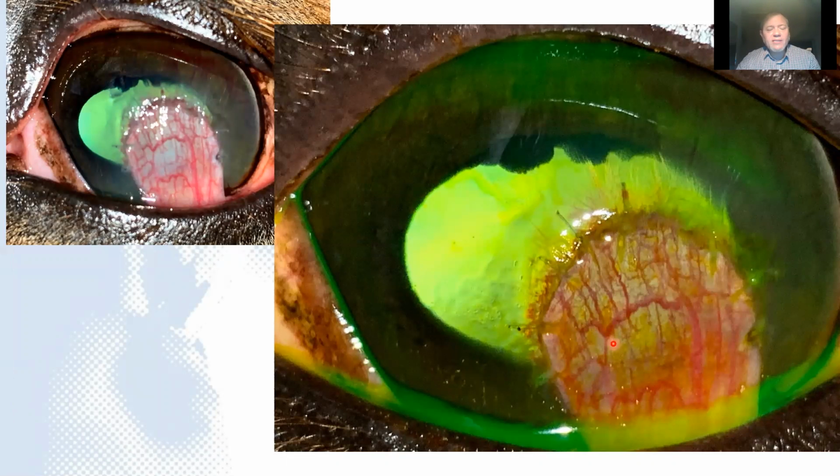Another similar case, another fungal keratitis with a conjunctival graft, and again we can see by just changing our angle of light that we can actually see through this graft. You can actually see the pupil going through here, which gives us a clue how thin this graft is, and allows us, by seeing through the graft to the stroma beneath, to know whether we're likely to have recurrence of the fungus.